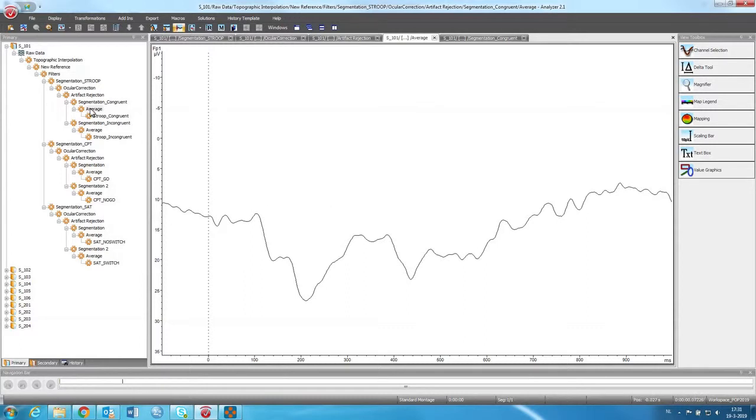So this is an average. You can also compute a grand average, which is over all participants. Because this is, although it's a lot of trials, it's still only one participant. So you still have some noise in the data, as you can see.